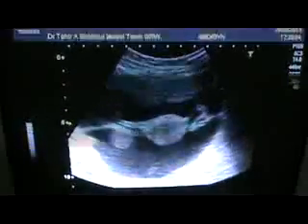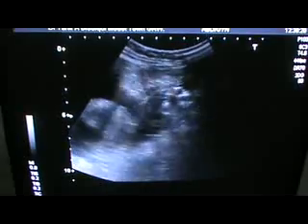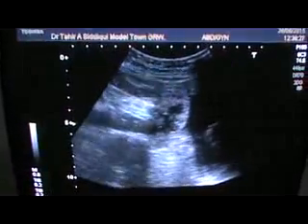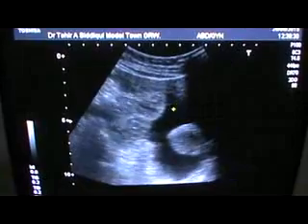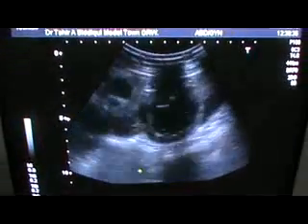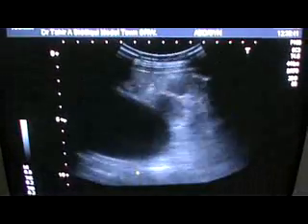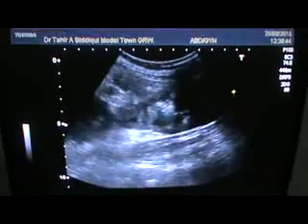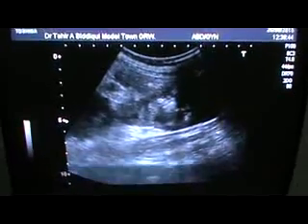Going towards the pelvis, we see that there is ascitic fluid — this is fluid with echoes within it. This is the ovary on the right side. This is the uterus in transverse section, and this is the uterus in longitudinal section. There is no pelvic pathology as a cause of the findings we have seen so far. This is fluid in the dependent region on the right side — malignant ascitic fluid. A small amount of fluid is also seen on the right para-aortic region alongside the iliac muscle on the left side.